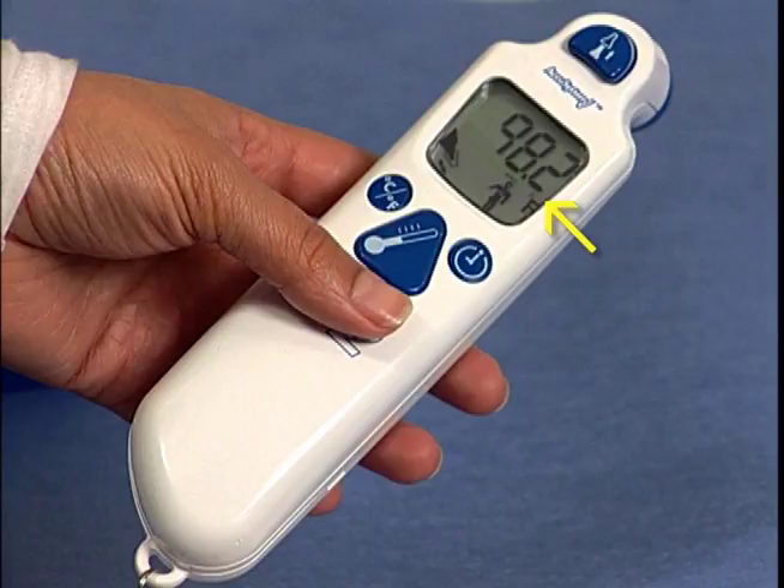The large easy-to-read LCD display shows the temperature reading as well as prompting you through all the steps of the easy temperature measurement process.